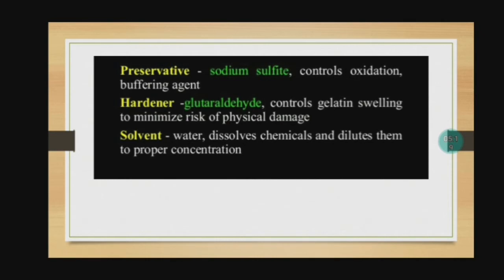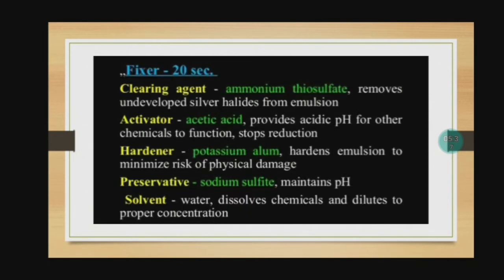Next one is the hardener, which is glutaraldehyde. It controls gelatin swelling to minimize risk of physical damage. Next is the solvent. It is where water dissolves chemicals and dilutes them to proper concentration.